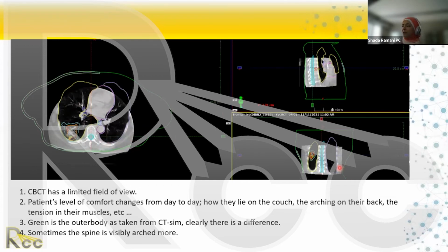If you also look at the coronal and sagittal cuts, we cannot see if we're aligning well to the body contour or not. So what do we do in this case? We try to use as much information as possible. Don't just focus on the tumor, because you could have different shapes, different deformable rotation that you would need to apply that your couch cannot do. Your couch cannot deform. It moves as one piece in this direction or that direction. I cannot move this part one way and this part another way.